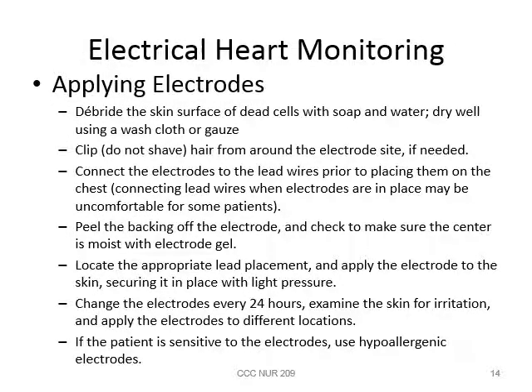There are some things you need to know about applying electrodes to a patient. If you do not have good contact of the electrodes to the skin, you're not going to get a good reading. This comes from your med-surg book. Here are some of the things you've got to do.